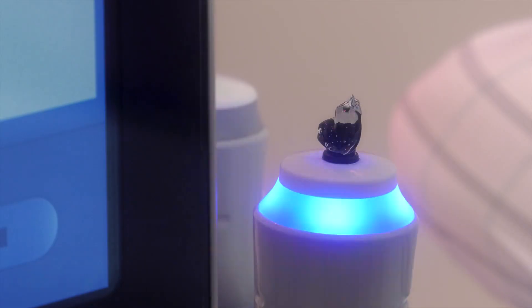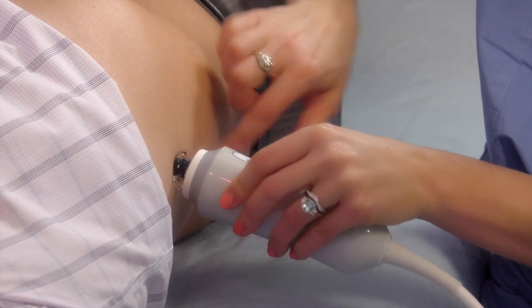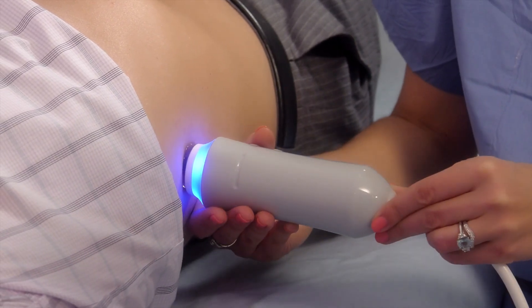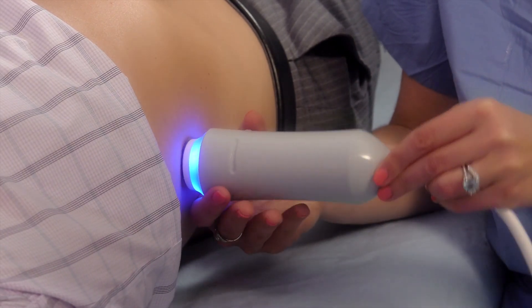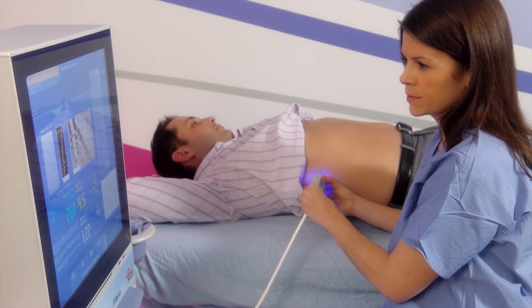After applying a water-based gel to the tip of the probe, the operator will position the probe in the space between your ribs. You will feel a slight pressure and a slight flick against your skin when the shear wave is created. You may feel about 10 flicks on your skin as part of the examination.